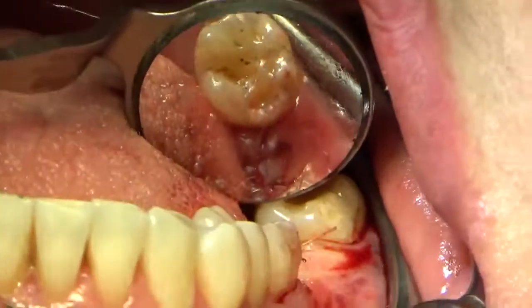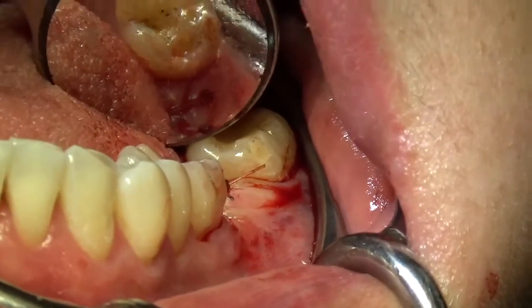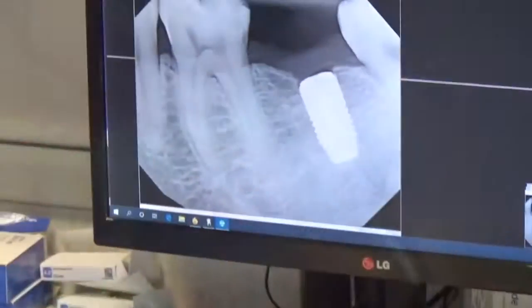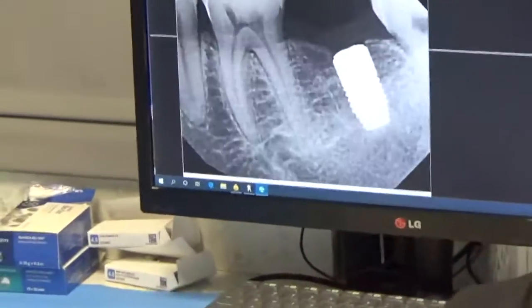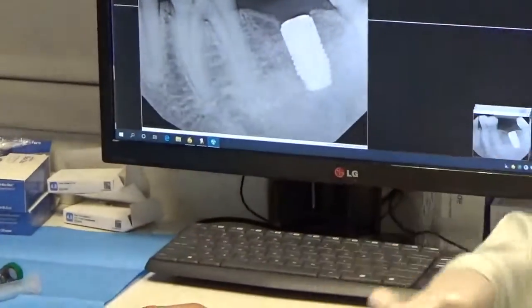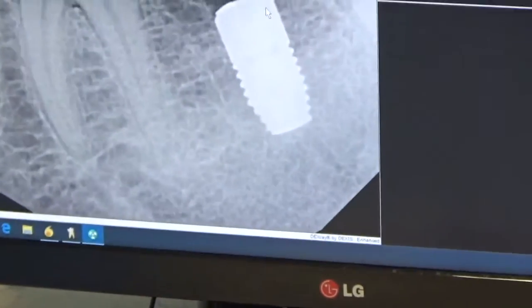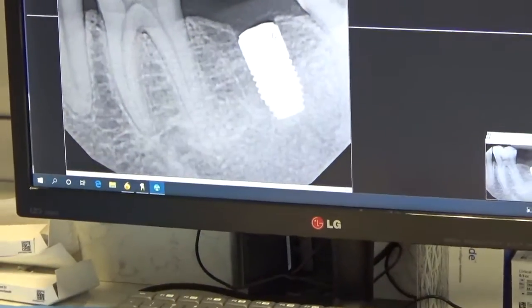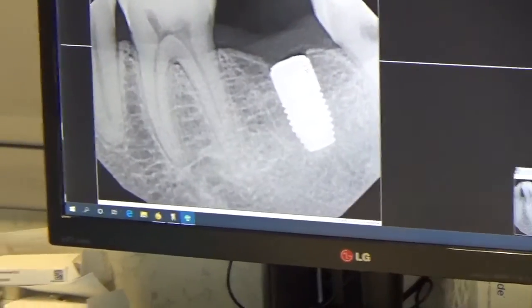Am I anticipating tons of swelling? No, I'm not anticipating tons of swelling with that, but it could. It certainly could anytime you add something. On the radiographs, you can see that countersink. You can see how that's approximately 1 millimeter below the crest of tissue. So what did we say? That tissue was about 3 millimeters thick. Planned it about a millimeter subcrestal there using our zero bone loss concepts.